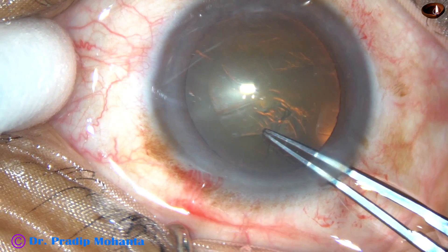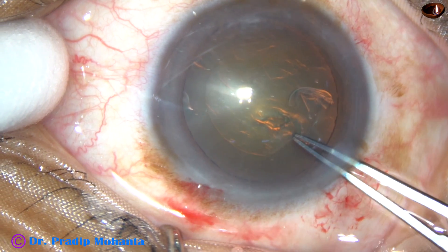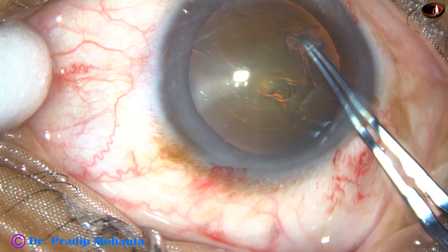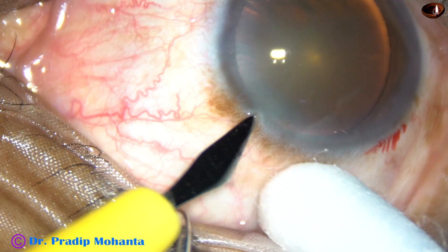And now the capsulorhexis is done. In this case, it is being done with the utarata forceps. Let us see this in slow motion.